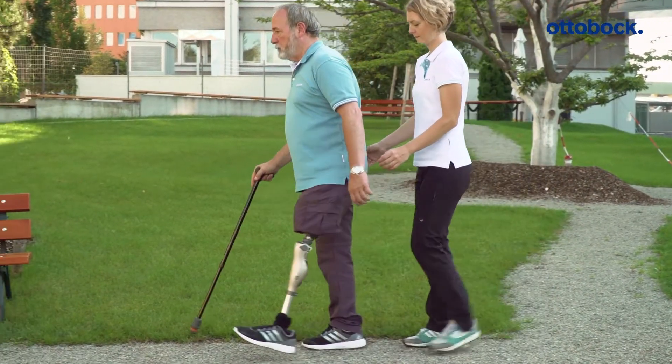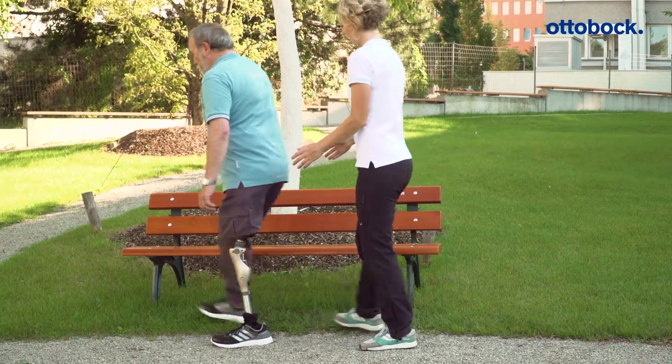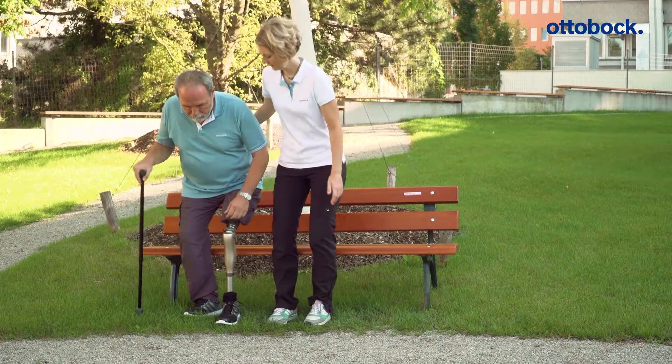Mode B is especially appropriate for users who have average prosthetic control with their residual limb, walk short distances, and walk slowly.